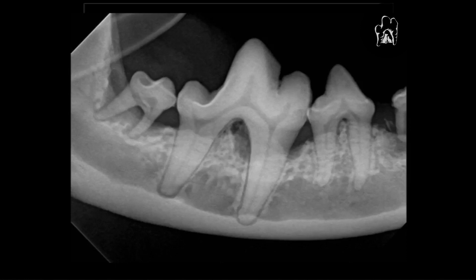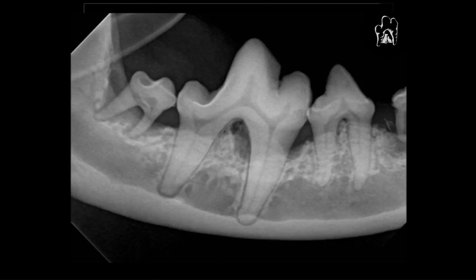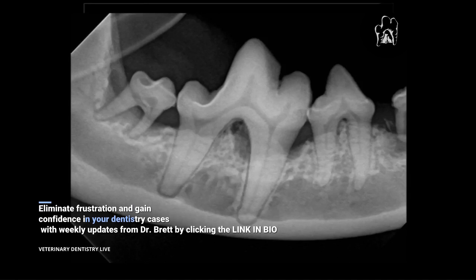Ideally, we would also place a bone graft in both of those defects. The furcation bone is very difficult to grow bone in. Once that's completed — once we've cleaned that out and got the bone graft in there — we suture between the teeth and oppose that gingiva right up where it was previously. And the most important thing before we even think about doing that is we have to get the owner's commitment to bringing that patient back every three to six months, or everything that we've just done is not going to work.